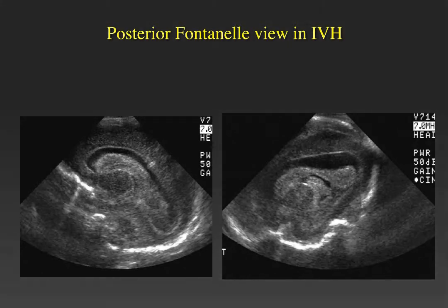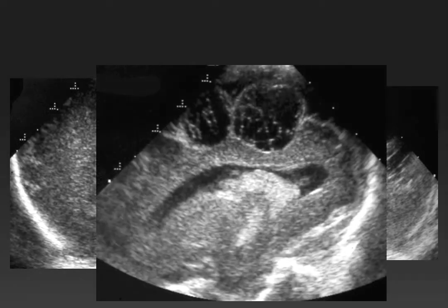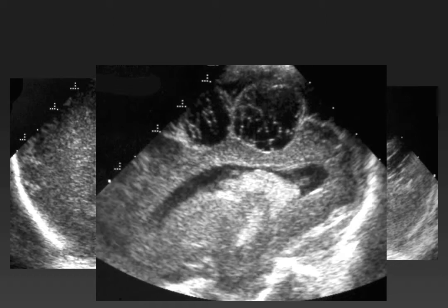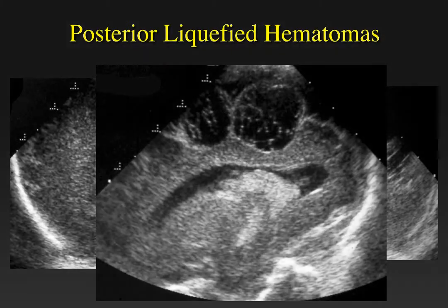In another example, we have an infant who had a complex cystic lesion in the white matter that was very peripheral, posterior, parietal, and occipital. Using the anterior fontanelle on these two views, we could not determine the extent of the lesion or whether it was all intraparenchymal or included an extra-axial component. Using the posterior fontanelle, we could see that these focal areas of complex fluid were, in fact, liquefying hematomas in the peripheral cortex of the brain.